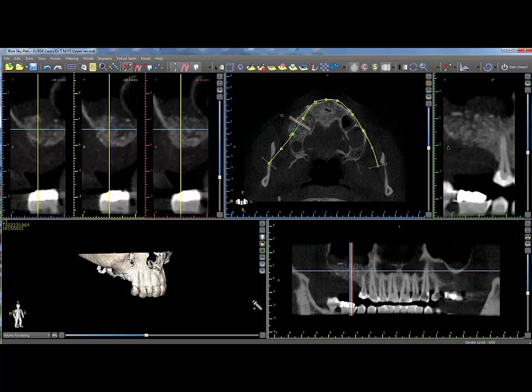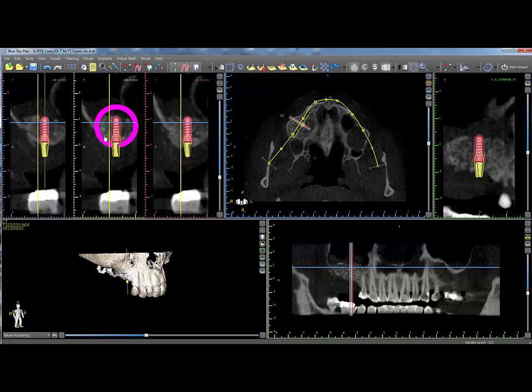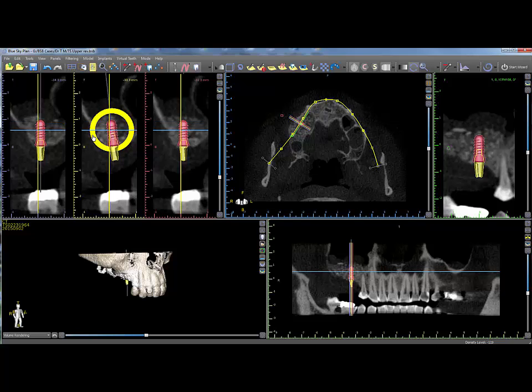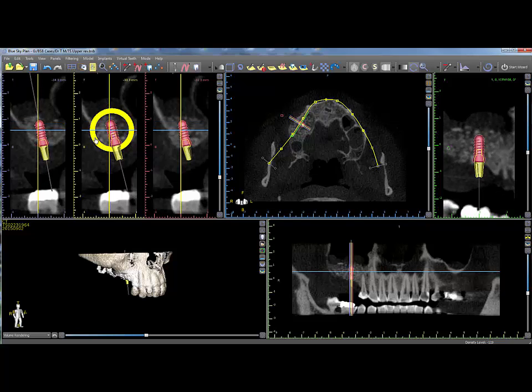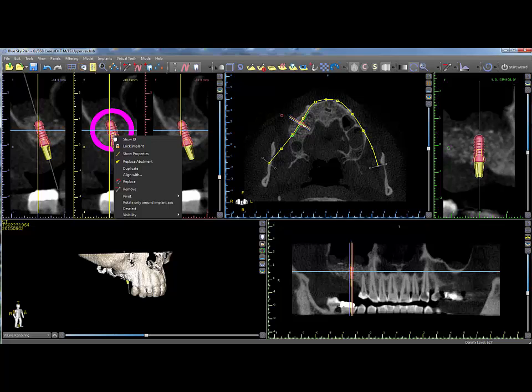Click OK, place the cursor in the appropriate position, and click to drop down the implant. The implant can be repositioned by directly dragging it or dragging along the circular widget in order to rotate. Right clicking on the implant will bring a drop-down menu with additional options.